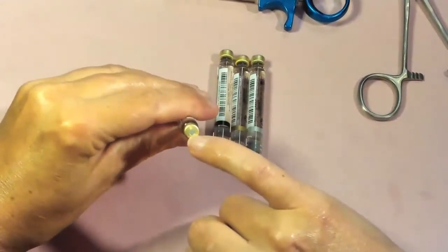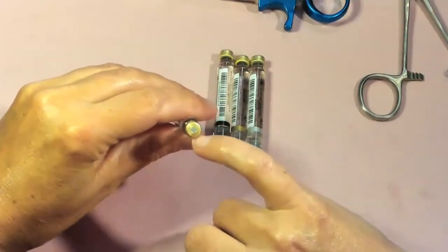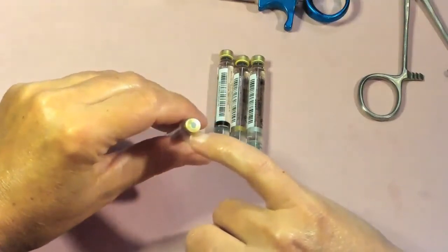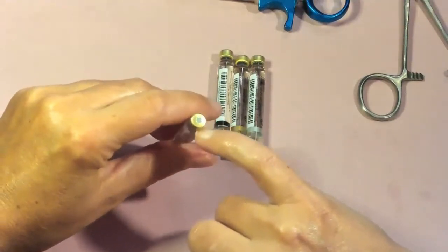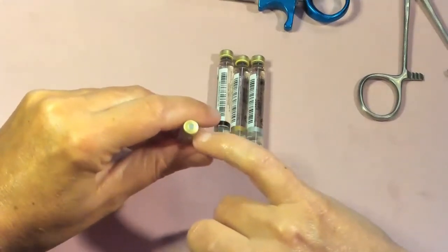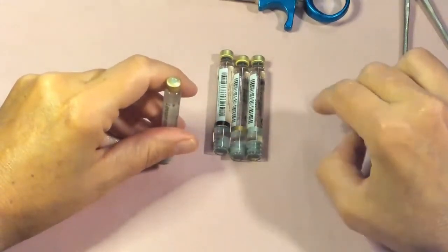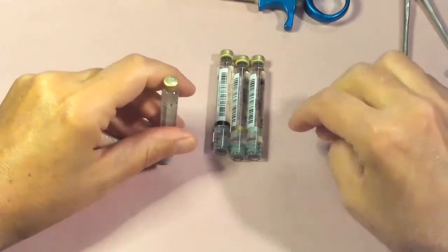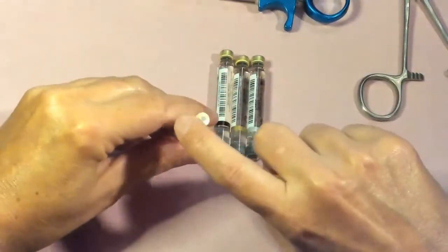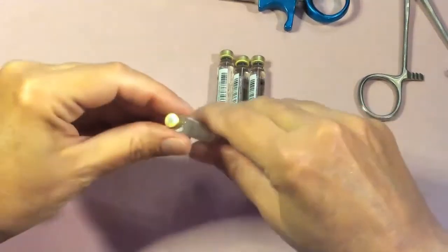There should be no pin holes in the diaphragm, which could occur if someone tried to use the cartridge previously but did not end up using it. Those cartridges should be placed into sharps or disposed of as indicated by policy. The metal hub should be clean with no rust or deposits.